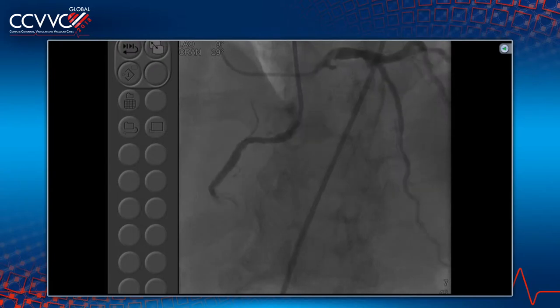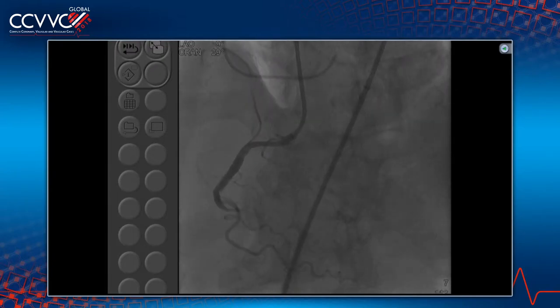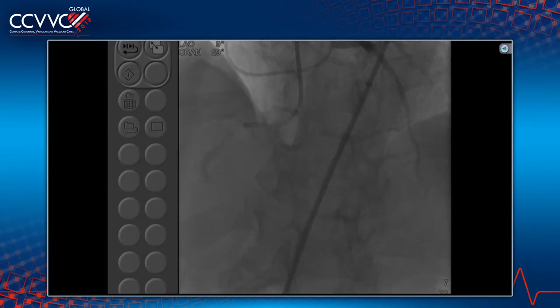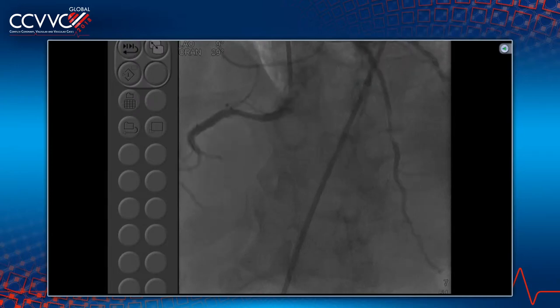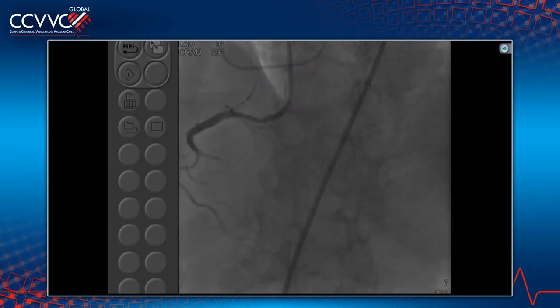Do you have access to the film during the stenting of the RCA, to at least get a full look at how that vessel used to look? Which one? The original stenting of the RCA, to make sure this vessel is actually straight. Looks like it's going to be straight, but at least that's good. Yeah, we have the old film. It is a straight shot, great.